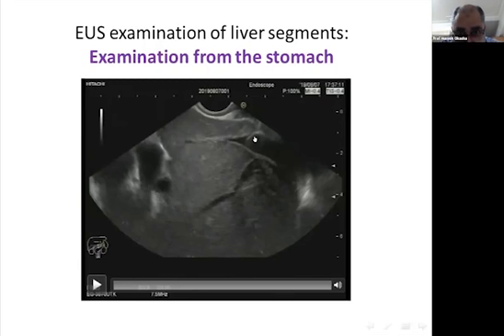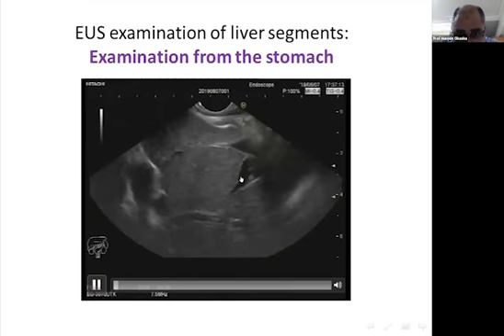This is the inferior vena cava, and this is the intrahepatic portion of the inferior vena cava, and this is the left portal vein, and this is the right hepatic vein. Why is it the right hepatic vein? Because the widest diameter of the right hepatic vein is its insertion inside the inferior vena cava, with gradual sloping or gradual tapering as it goes deeply inside the liver parenchyma. So this is the IVC, and this is the right hepatic vein.